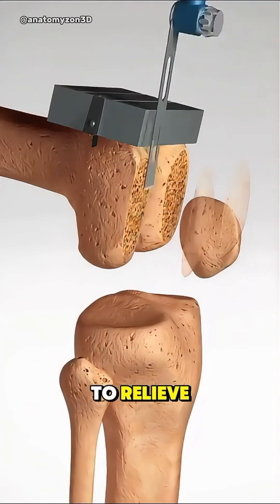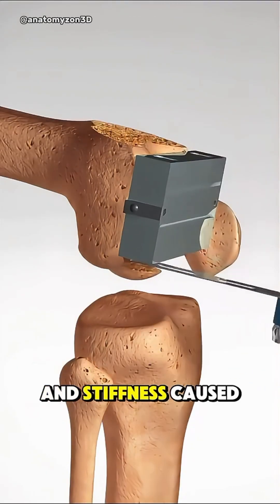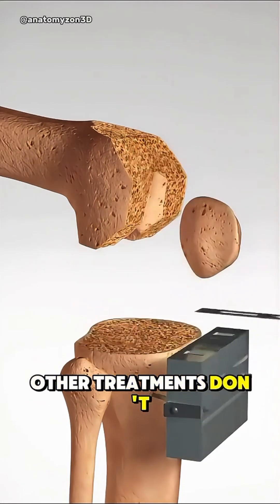Total knee replacement surgery is done to relieve severe pain and stiffness caused by arthritis or injury when other treatments don't help.